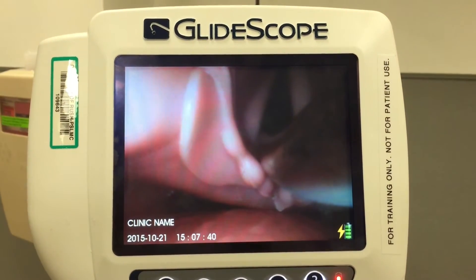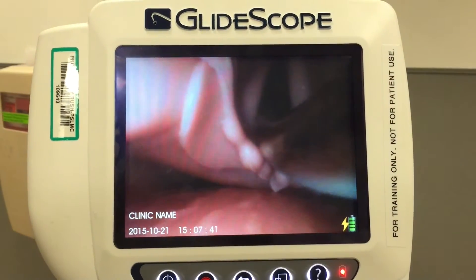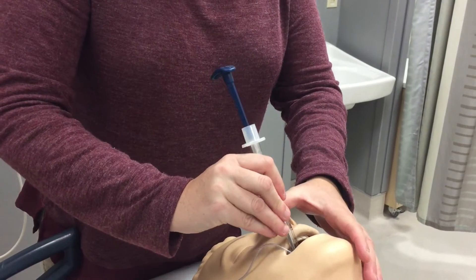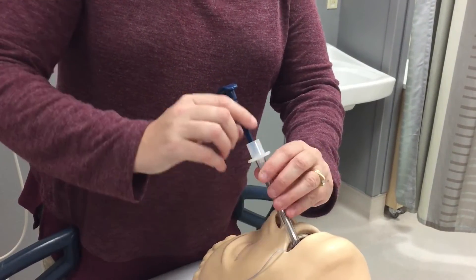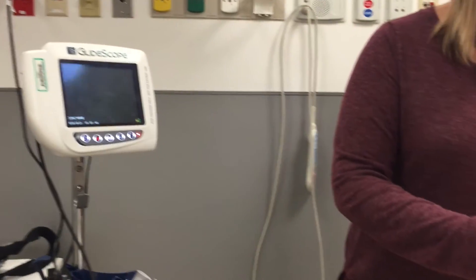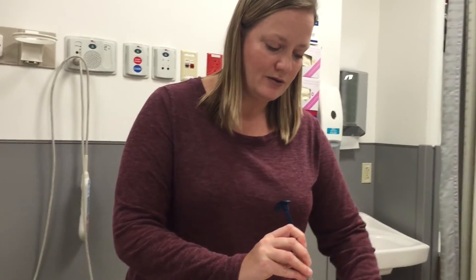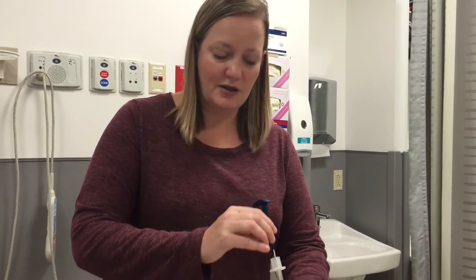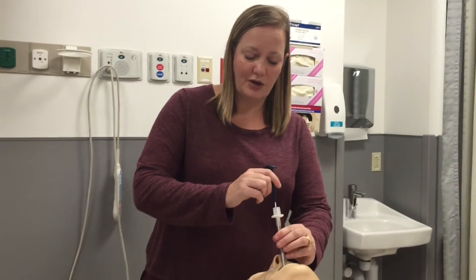Once you see the balloon go past the cords, you will pop the stylet just a little bit and advance the tube. At this point you may take the GlideScope out of the patient's mouth, making sure that you're holding on to the endotracheal tube.